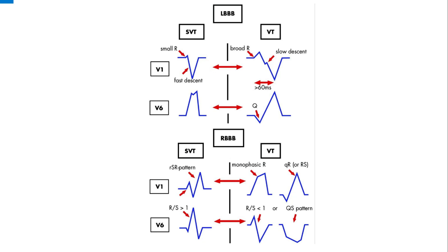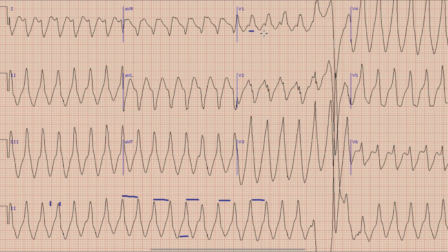Now we will apply the Brugada criteria to our case. The first step is to look for concordance. We can see that V1 shows a tall R wave, and there is an S wave in lead V2. Similarly, there is an R wave and deep S wave in lead V6, so absence of concordance is ruled out and we move on to the next step. The distance between the R wave and the nadir of the S wave is around two small squares, which is 80 milliseconds, meaning this is not ventricular tachycardia as per the second step of Brugada criteria.